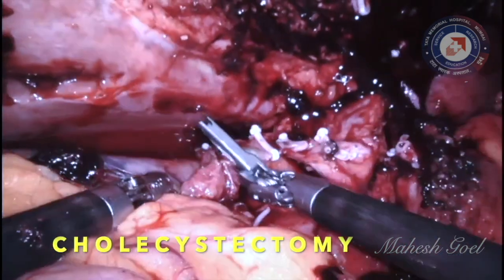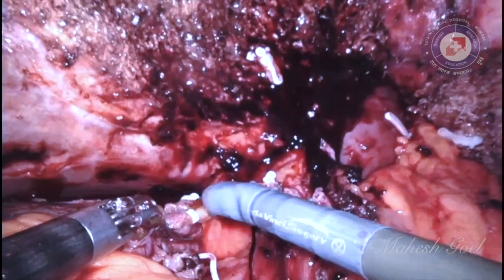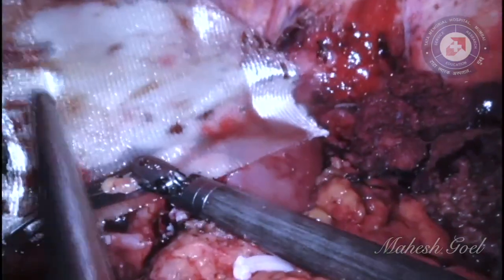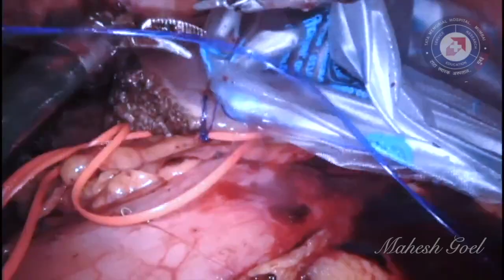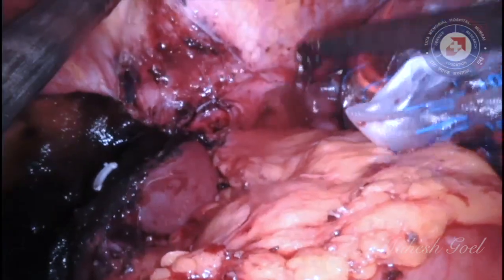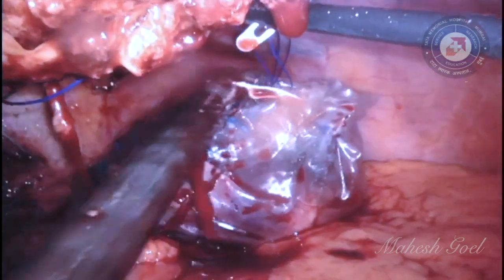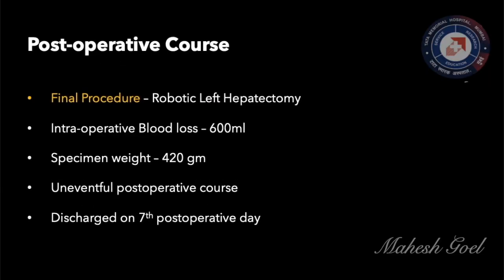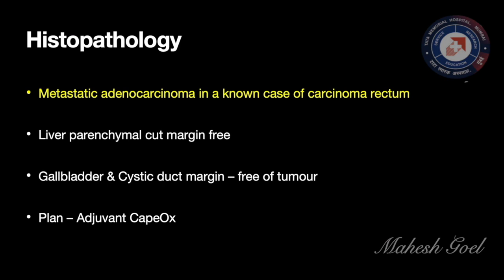Cholecystectomy is completed. Meticulous hemostasis is achieved and an absorbable hemostat is placed over the raw transected surface. A specimen bag is introduced into the abdominal cavity and both the transected liver and the resected gallbladder are placed within the bag. Specimen retrieval is done through an opening created by communicating two of the robotic ports. With a total intraoperative blood loss of 600 cc, our patient was discharged on postoperative day 7 with an uneventful course. Final histopathology confirmed metastatic adenocarcinoma of the rectum with clear margins, and the patient is planned for adjuvant CAPOX.